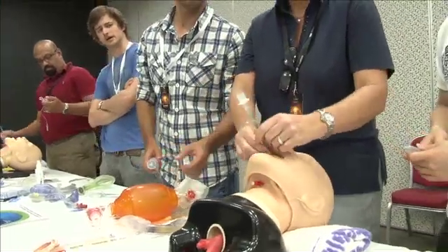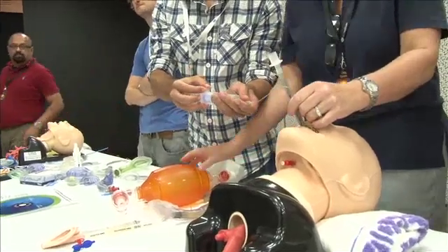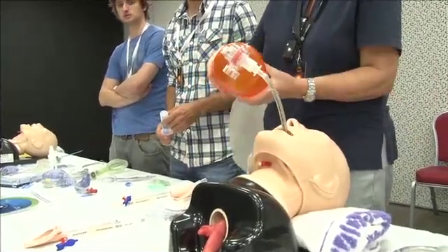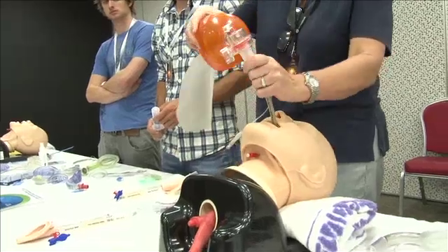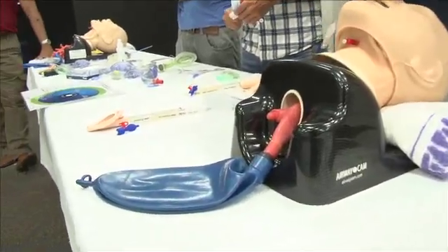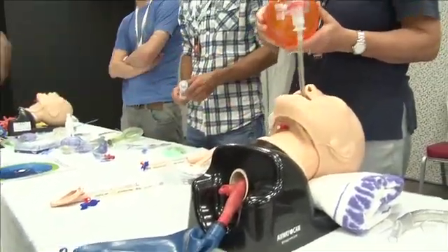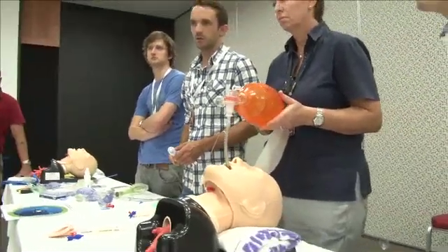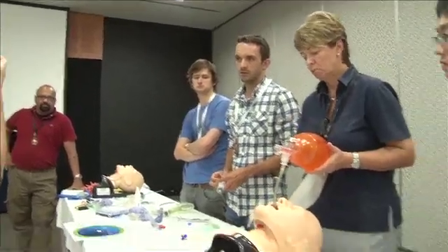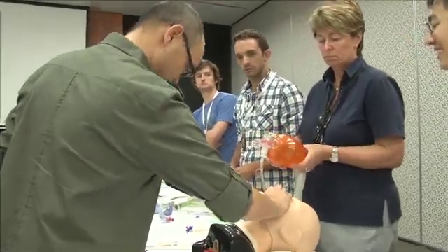Are you going to get a lot of gastric? Yeah, that's the problem with this device. But there's also another problem - if you just do it like that, you actually won't be able to ventilate. See there's a big leak? So how do you fix the leak? There is a way you can fix it - something simpler, something an assistant can do. So you just need to occlude the nose and the mouth, and you should be able to ventilate.